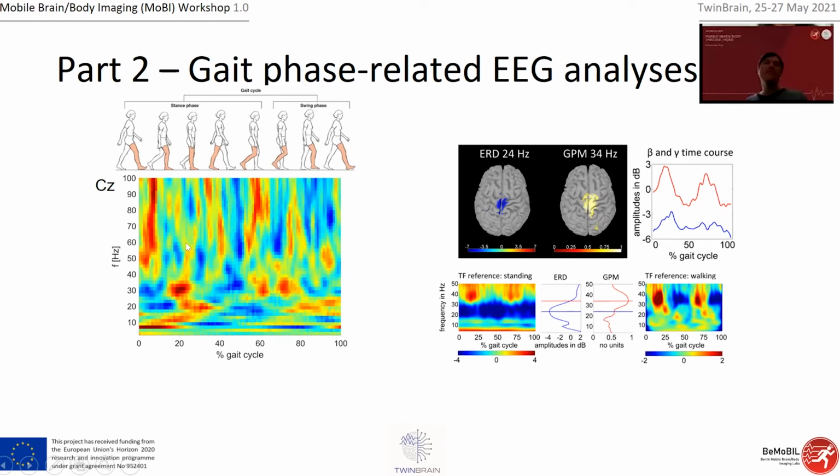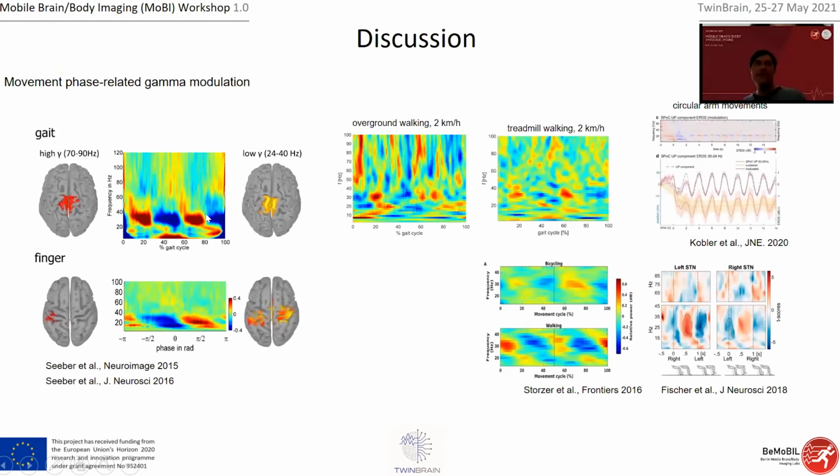What I wanted to discuss and highlight is that I believe those broadband spread components are artifacts. And this is all scalp analysis so far. It's not source, it's not hyper clean, but the phenomena we discuss are the same as we showed before. And we can just add that.